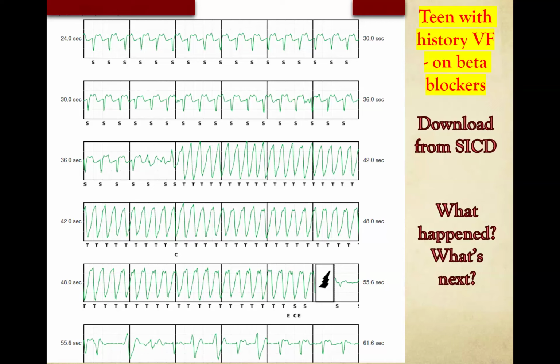And the question you're asking is exactly why, for example, when I put in devices for people with things like long QT syndrome, which, as you know, we try not to put in patients with long QT, but sometimes we're forced to, I almost always will put a dual chamber system in on the theory that the patient may benefit from atrial pacing.